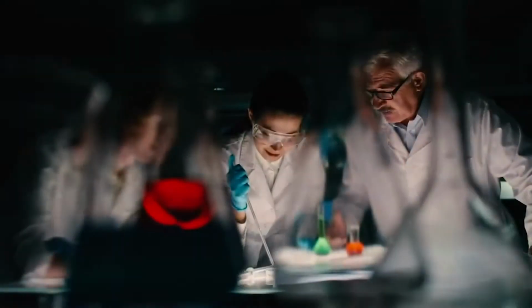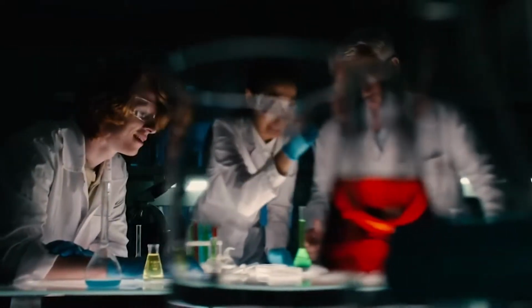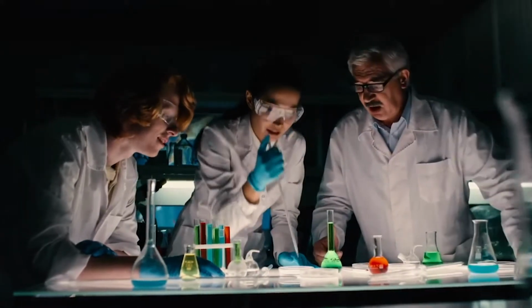So the difference between pool saliva surveillance testing and a medical test is, of course, the scale. In a pool saliva, we have anywhere from 3 to 100 individuals that are contributing to a pool, and that becomes the group that's tested. The saliva from each individual is pooled to a composite sample that's tested. In contrast, to sample all 100 people medically, every individual person has to have a sample collected from them personally, and 100 tests have to be run versus the one test in a pool of 100.